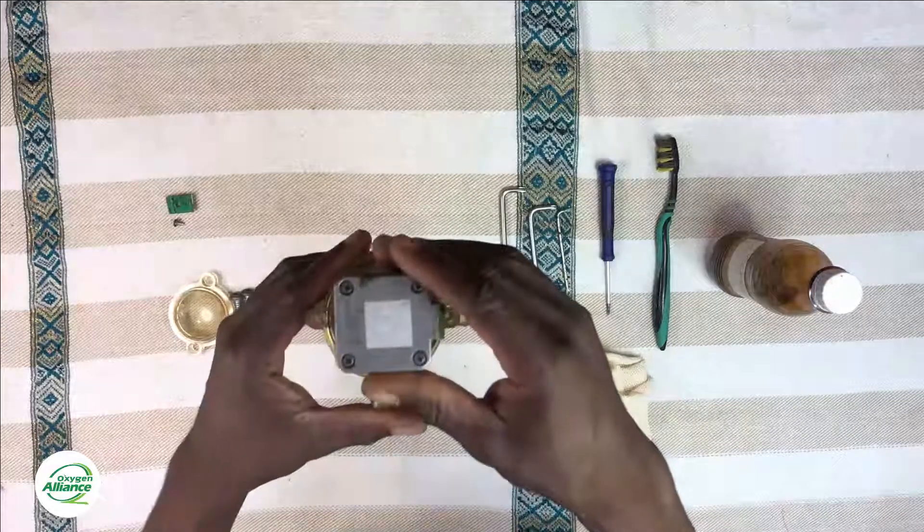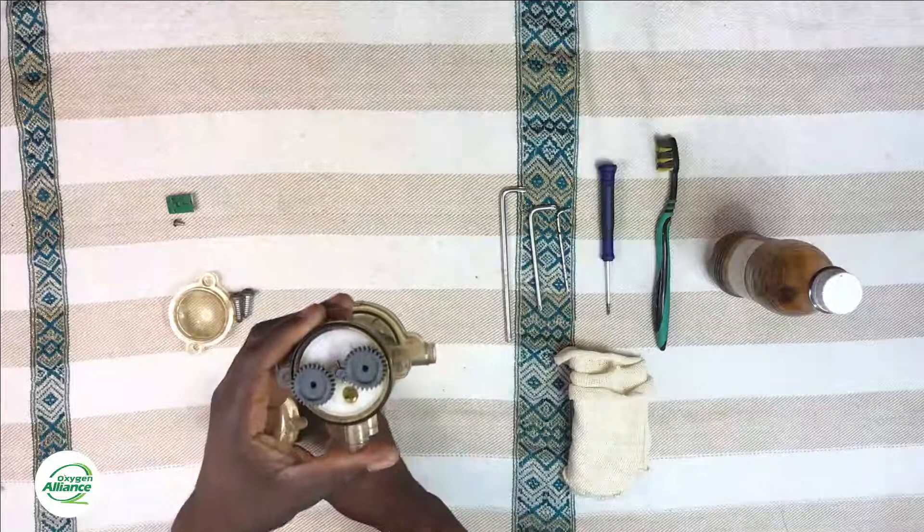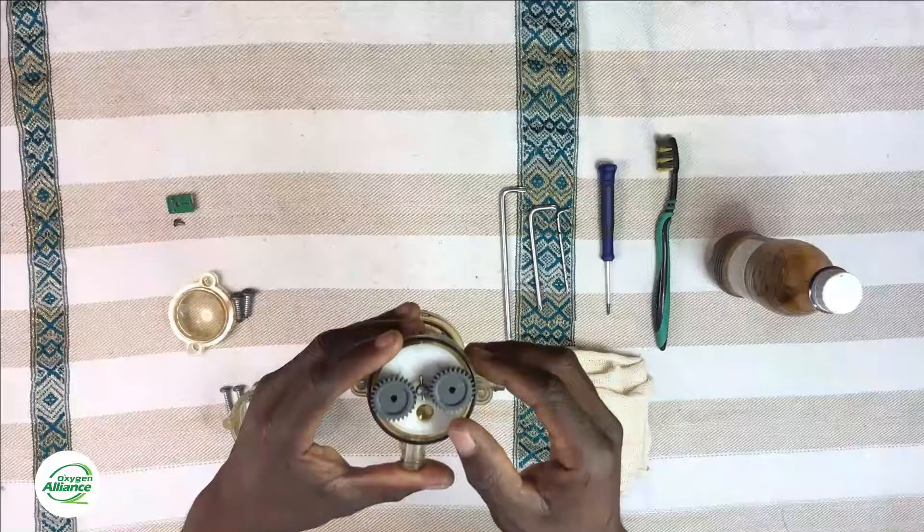Once you remove the screws, you can now pull up the stepper motor, and as you can see it comes off together with the top cover. The stepper motor is screwed to the top cover, that's why it comes off together.